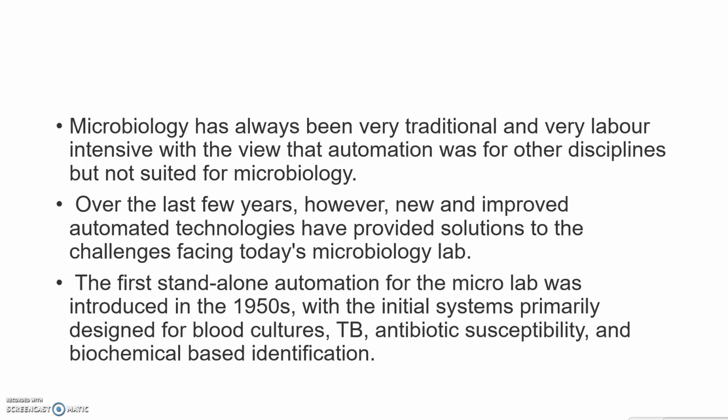Over the last few years, however, new and improved automated technologies have provided solutions to the challenges which we are facing in today's microbiology lab. The first stand-alone automation for the micro lab was introduced in the 1950s, with the initial systems primarily designed for blood cultures, TB, antibiotic susceptibility, and biochemical based identification.